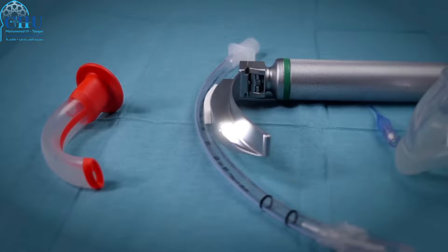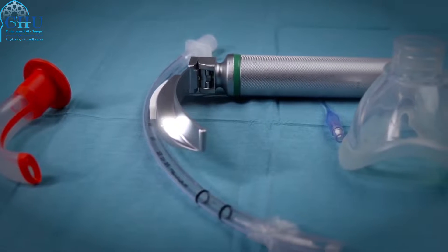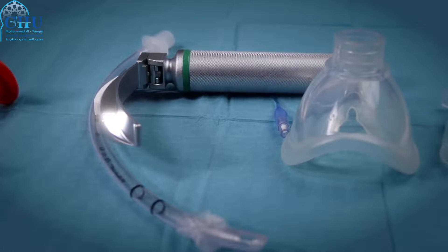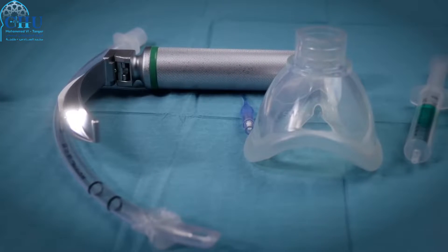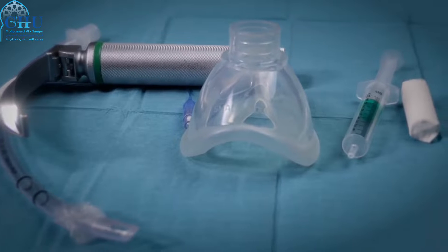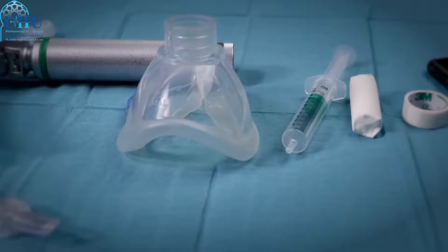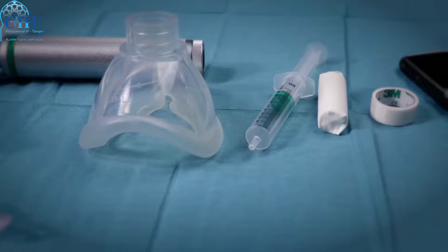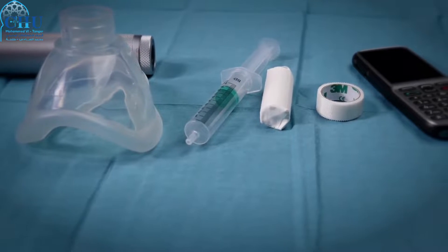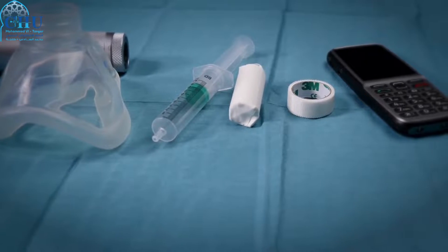Endotracheal intubation is an important part of airway management. It is best learned through practice under expert supervision — first on a mannequin and then on elective, uncomplicated and fasted patients. This lesson aims to prepare you for these practice sessions, with a narrow focus on teaching the manual skills that will increase your chances of success.